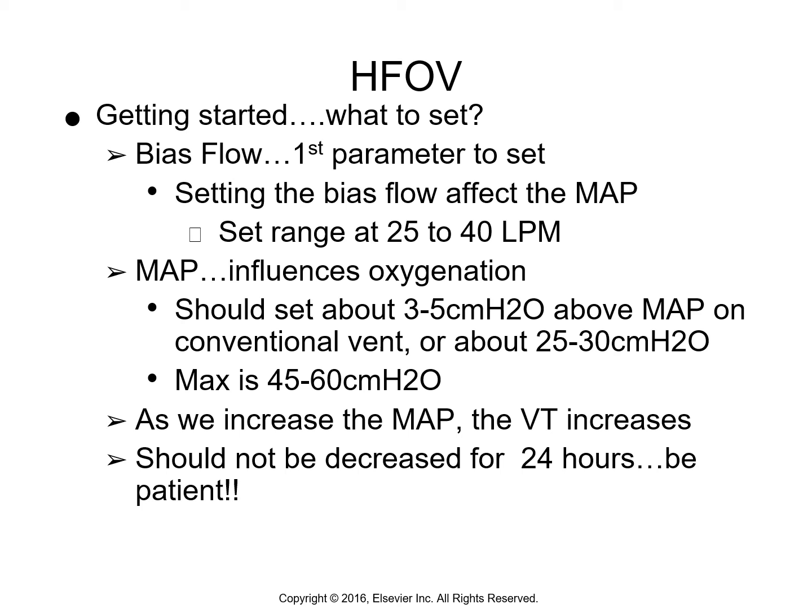As we increase the MAP, the tidal volume also increases, because we're just providing more pressure there. And then you should leave it alone. That's one thing about the oscillator, that you don't want to be making a lot of changes really quickly. They tell you to just sit on it for a little bit. So wait it out for about 24 hours or so to see your results, because you're not going to see it as fast as you are on a conventional ventilator.